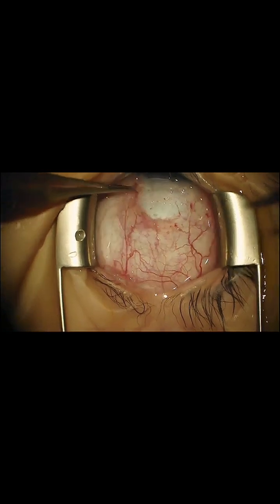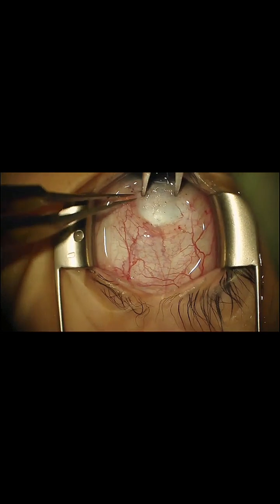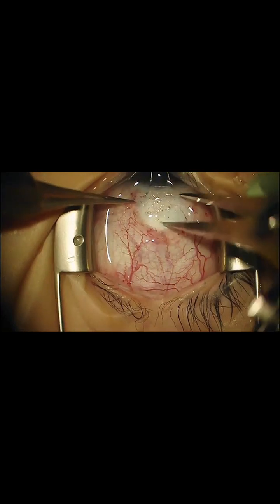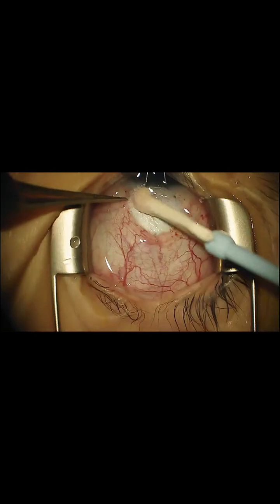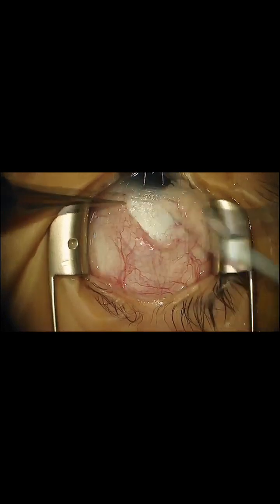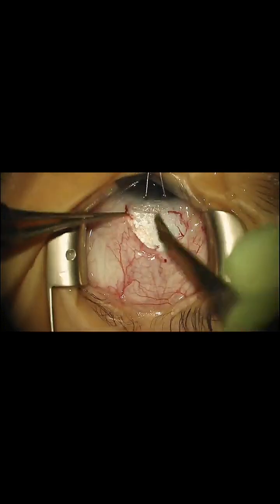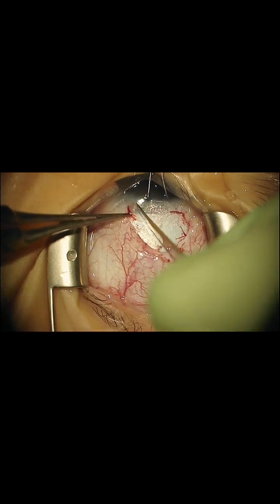If I do a trabeculectomy, yeah, I would still do a triangle. I really don't find them to be terribly helpful in children. To form this triangular flap, there are lots of different blades you can use. Some people use a 75 blade. At home, I have a guarded blade. It's a 300 micron guarded blade, and you just press it down, and it won't go more than 300 microns deep. So I'm going to start our triangular flap here.